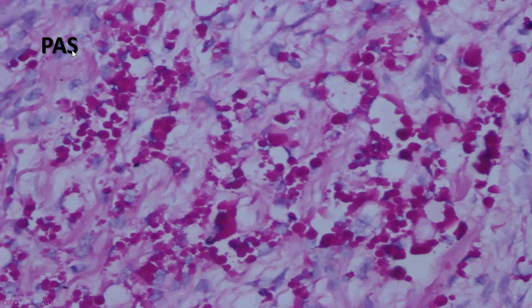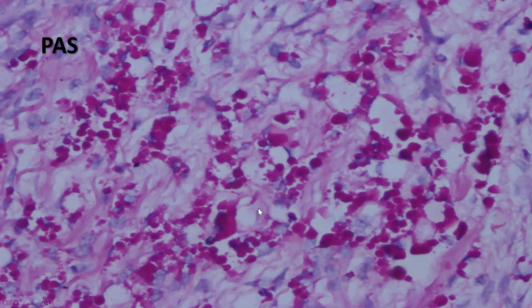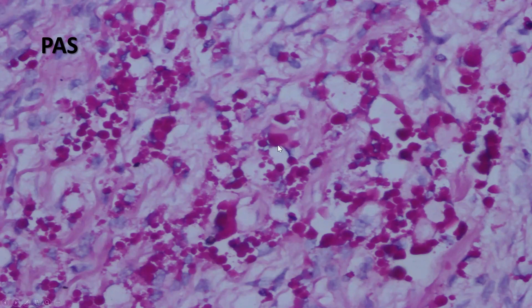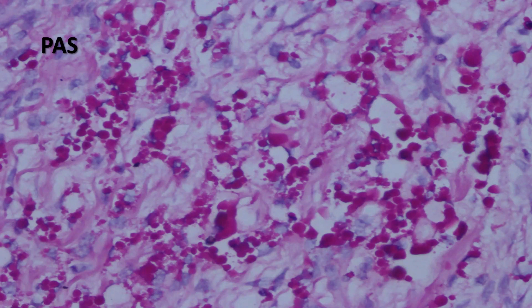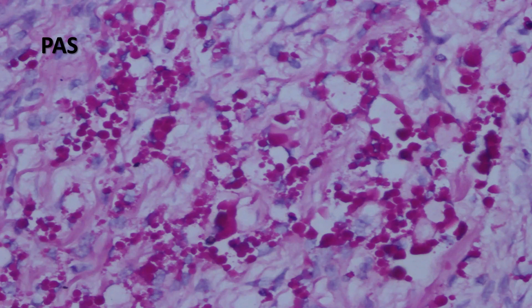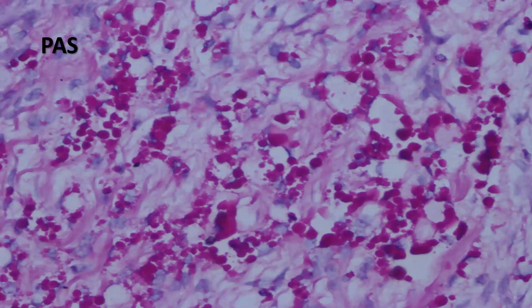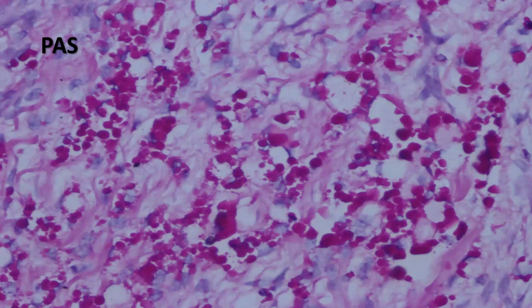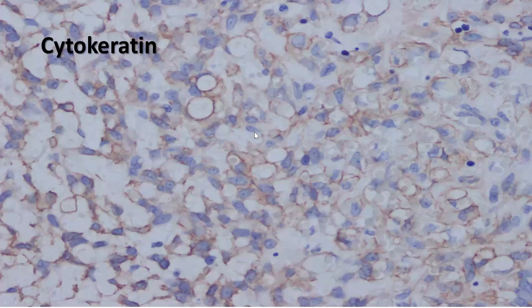Remember that with the PAS stain, within the cells themselves, there is no evidence of mucin. So the PAS can also be helpful to rule out the presence of intracytoplasmic mucin, which is seen in metastatic signet ring cell carcinomas.